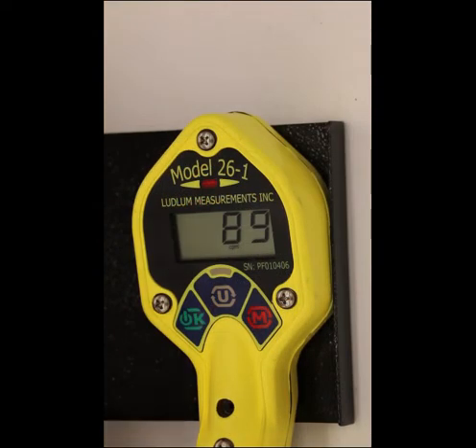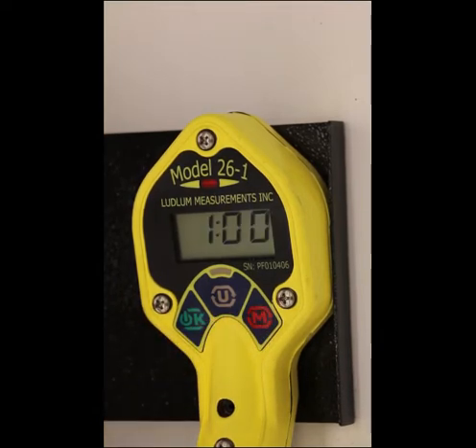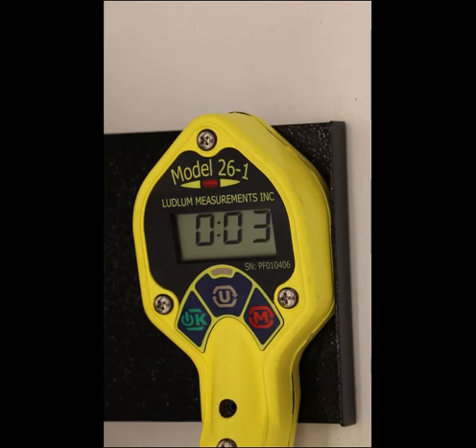Press the mode button until you enter the count mode. When you enter count mode, the currently selected units will display for about one second. Pressing the OK button will initiate the count. At the end of the count time, the results will be displayed.